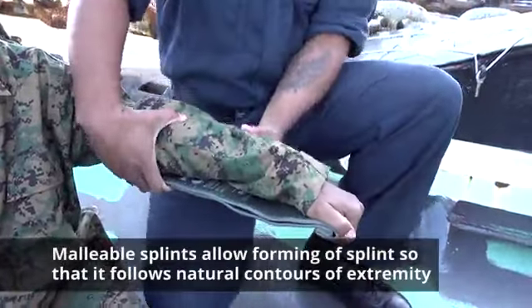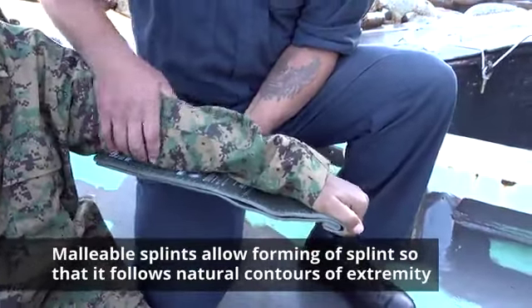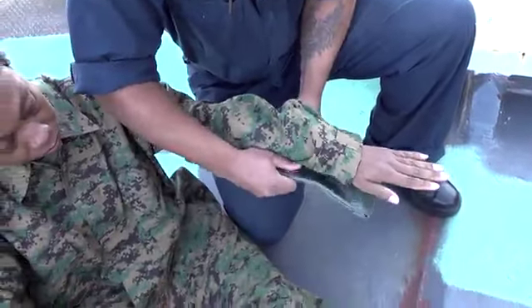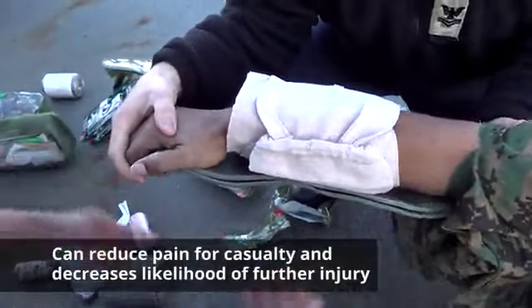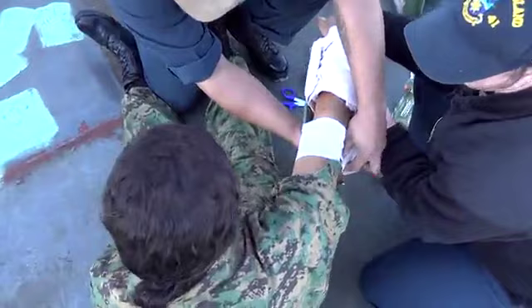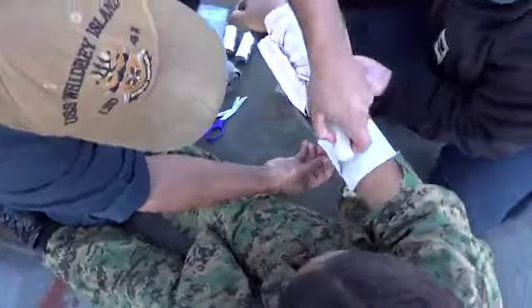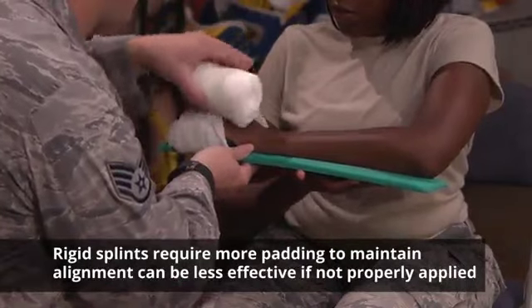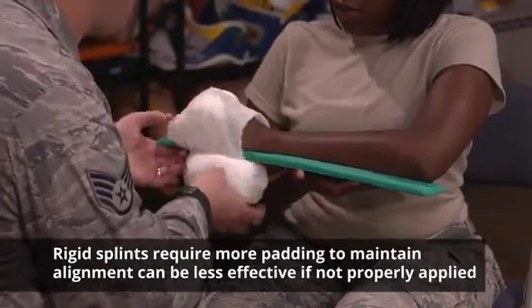In malleable splints, there is an opportunity to form the splint so that it follows the natural contours of the extremity and more readily secures the fracture in its normal anatomic alignment, which often reduces the pain for the casualty and decreases the likelihood of further injury, which are two of the primary objectives of splinting. Rigid splints require more padding to maintain that alignment and can be less effective if not properly applied.